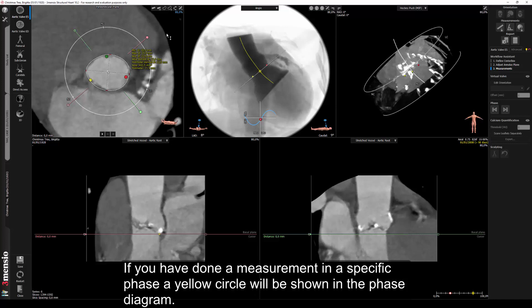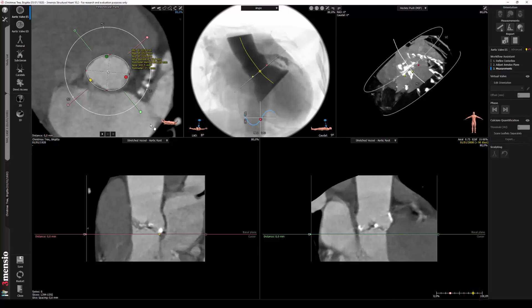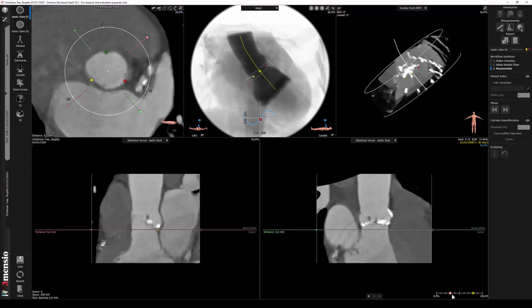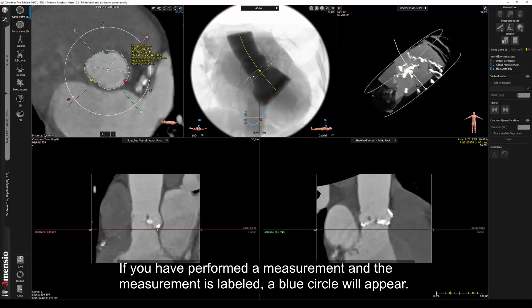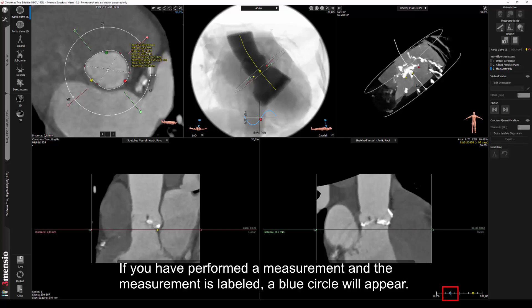If you have done a measurement in a specific phase, a yellow circle will be shown in the phase diagram. If you have performed a measurement and the measurement is labeled, a blue circle will appear.